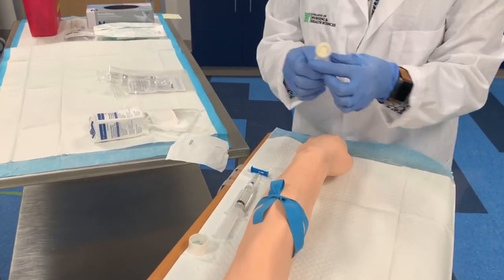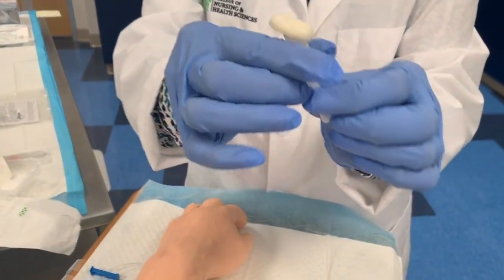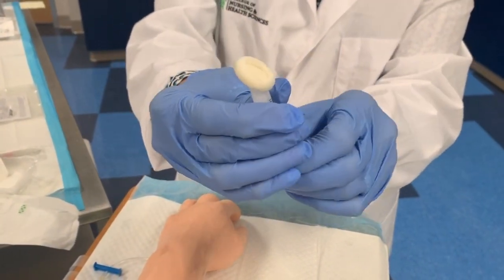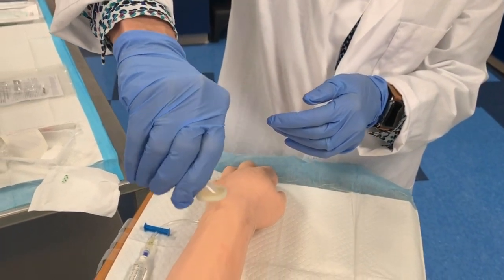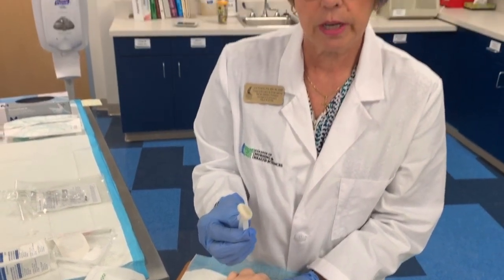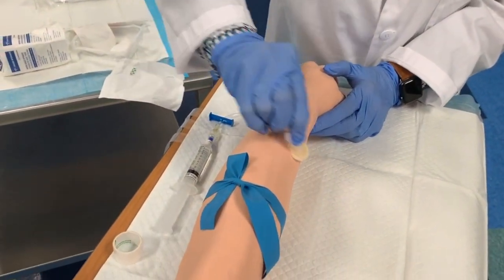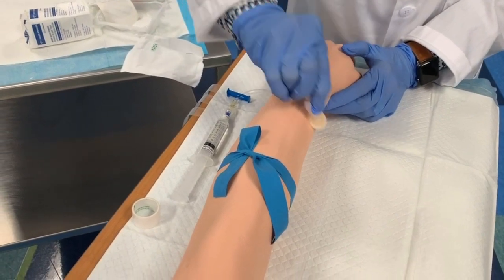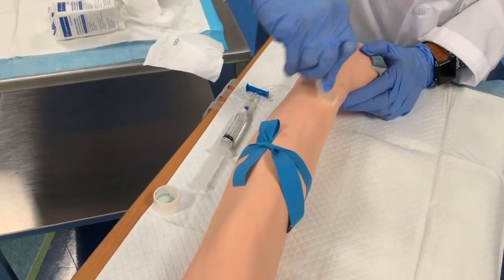Okay, so first thing we're going to do is activate our cleanser. So this is a chlorhexidine prep sponge. And inside we have our cleanser, and you need to squeeze the handles and then put the tip down and give it a couple squeezes, and that brings the cleanser to the surface. Now, if you have alcohol-based cleanser in your IV start kit, we're going to use those a little differently. For chlorhexidine, we can just scrub the patient and go in back-and-forth motions over the site. And I like to prepare a big site, so usually we start horizontally and then we can go vertically.